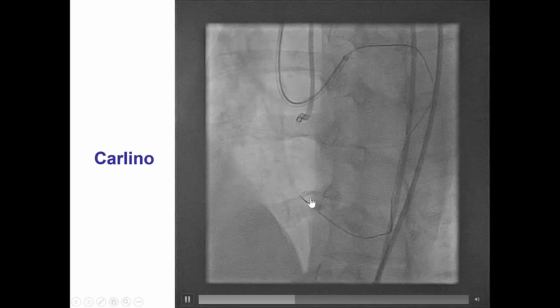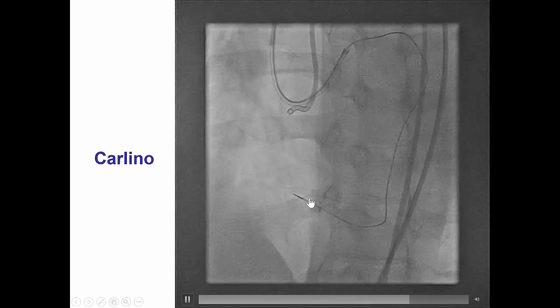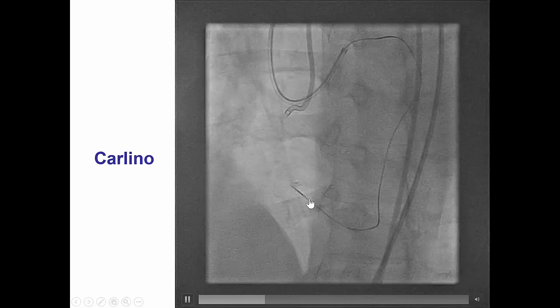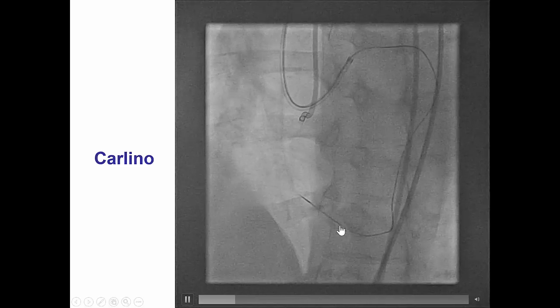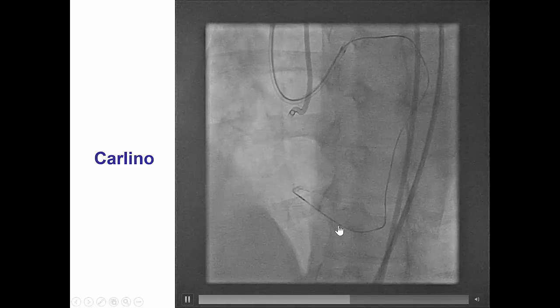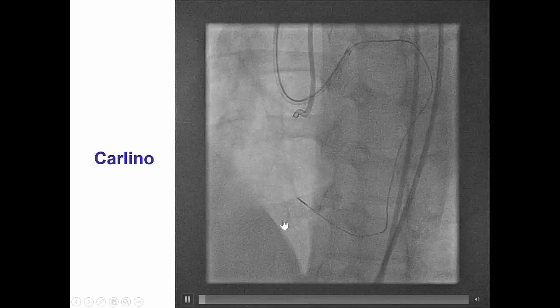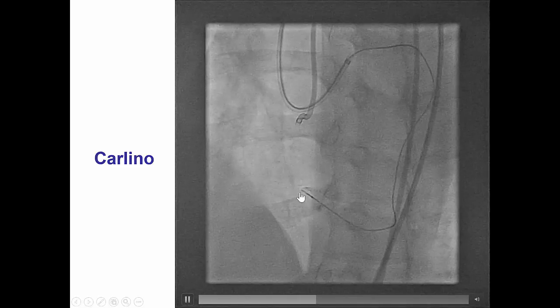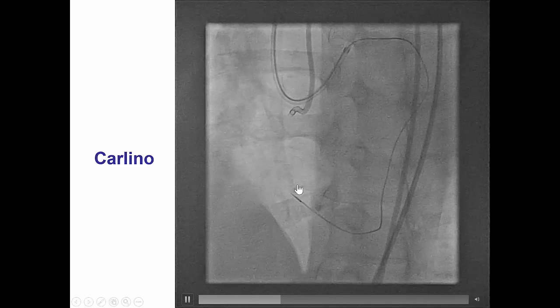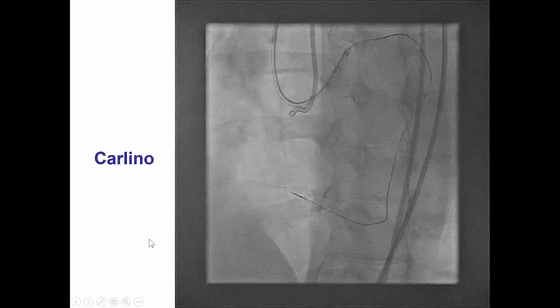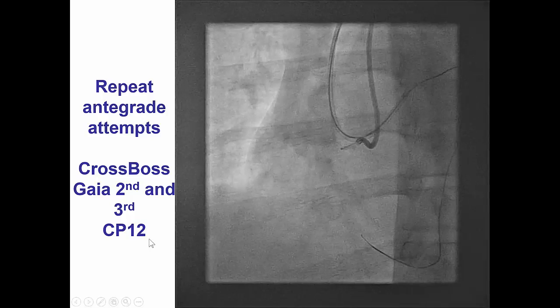We advanced our Corsair all the way to the bifurcation and did contrast injection using the Carlino technique, trying to modify the distal cap, but unfortunately all we were seeing was the contrast entering the posterolateral.